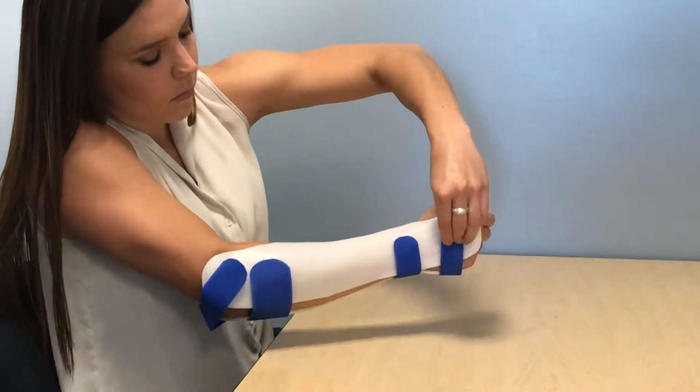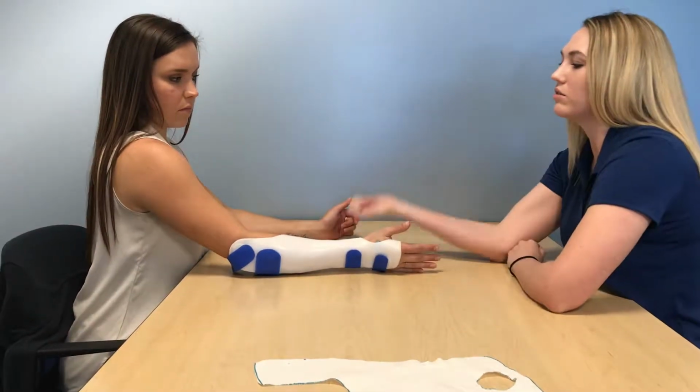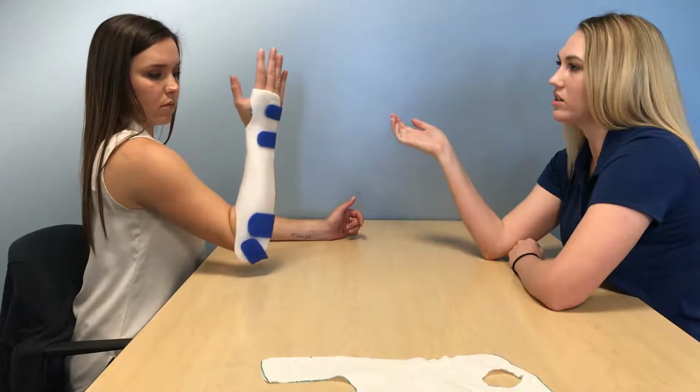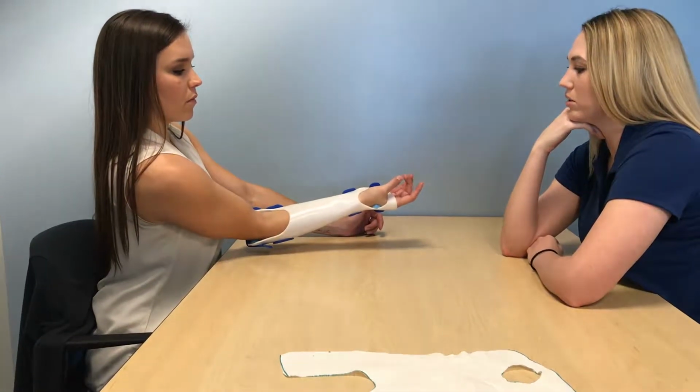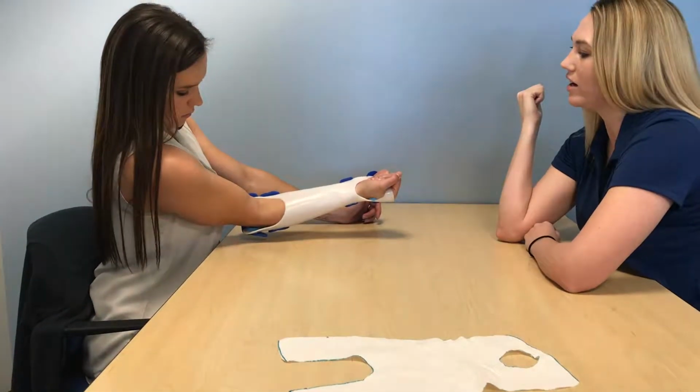Great. And we're going to do the same test that we did with the pattern. So can I see you flex and extend your elbow? Great. Can I see you oppose all digits using your thumb? Perfect. And then can I see you make a full fist so that she still has functional grasp?